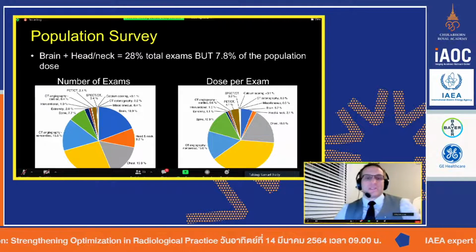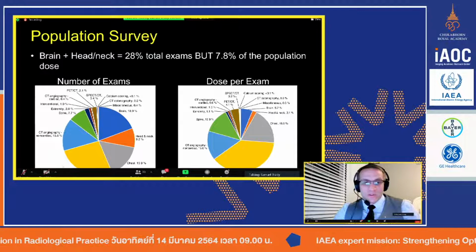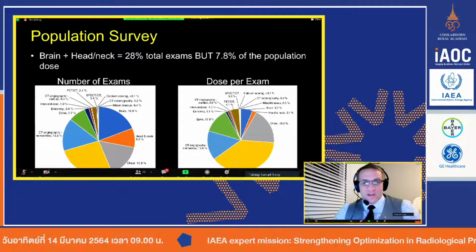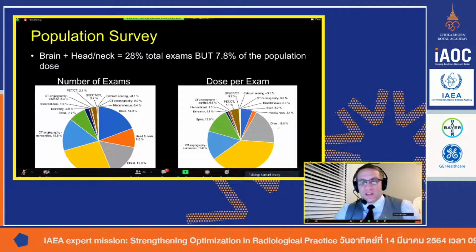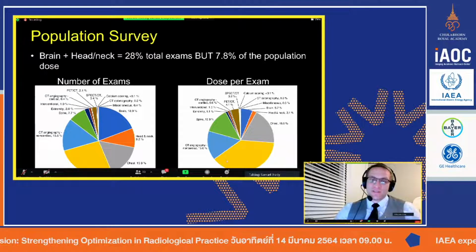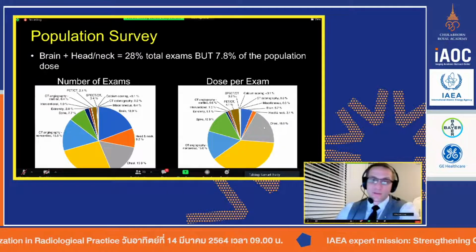And so that's why when you look at the overall dose burden, 26% of the scans in CT are for the abdomen, pelvis, but the dose burden here is 38%. In chest, we do about 16%, and here it's 18% dose burden. So when we look at the chest, abdomen, pelvis, that is a big chunk of the dose pie over here, which we'll talk about next week.